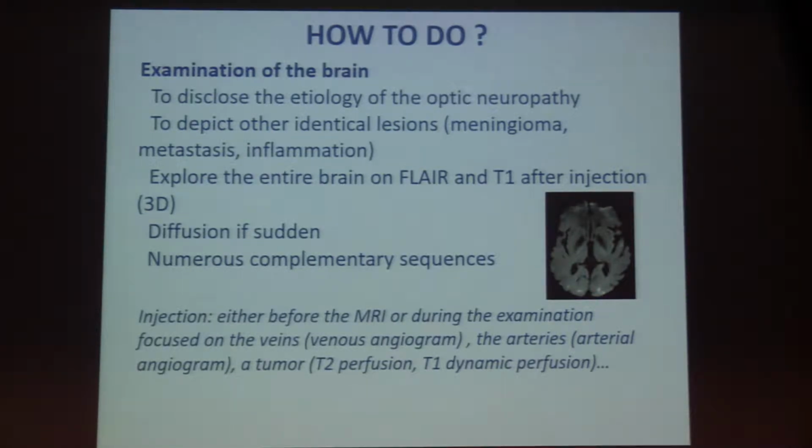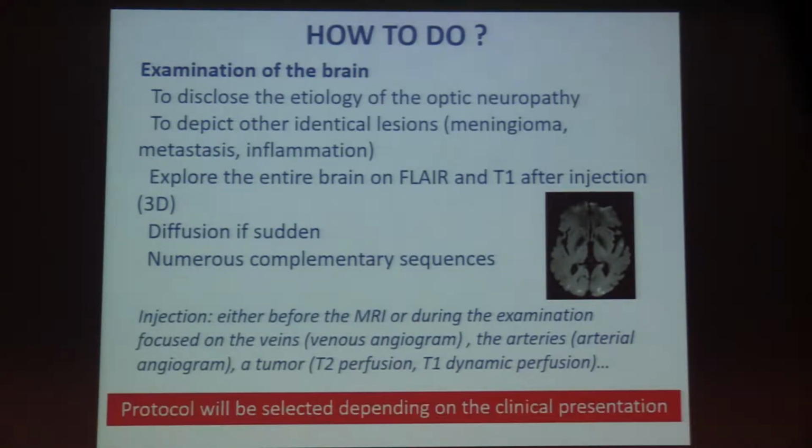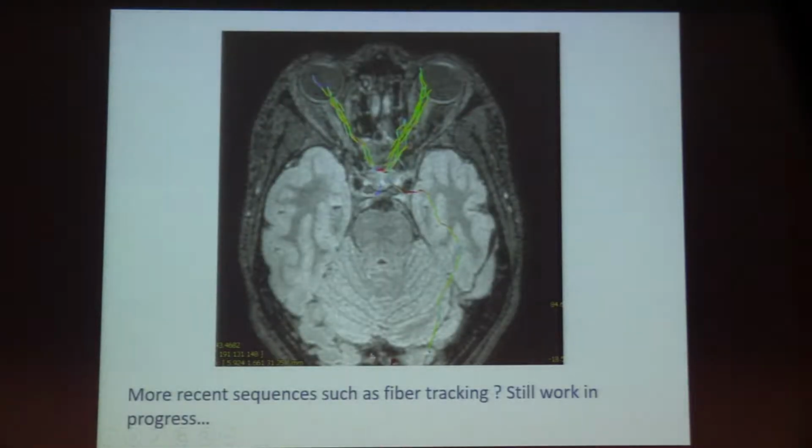with another injection has to be perfect. Try to do it at first time. And of course, the protocols will be selected depending on the clinical presentation.